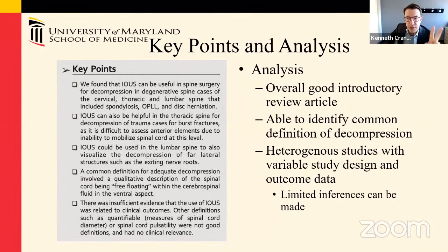But the two main probes that most of the actual intraoperative ultrasound machines can accommodate or potentially even come with are a cranial probe, which works very well, and then there's this special probe that looks like a hockey stick. That's the one more generally related to spine surgery and was more or less developed for spine surgery. The actual end of the probe is probably about 2 centimeters or so in length, and it's shaped in a way where you can hold it and put it into smaller areas.